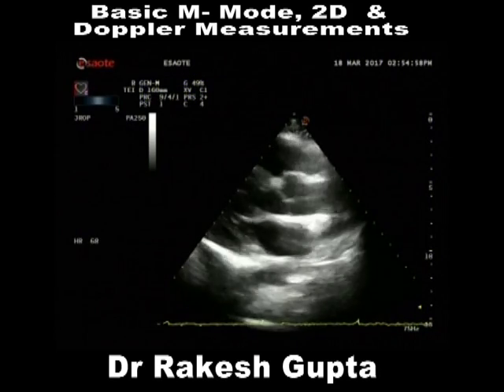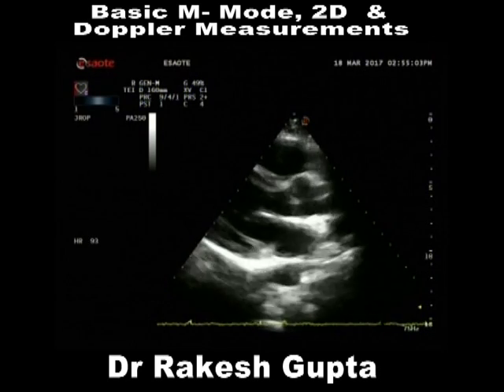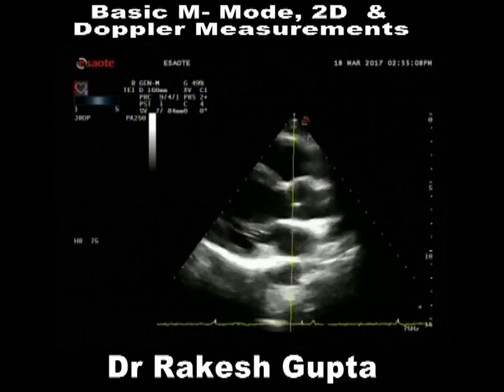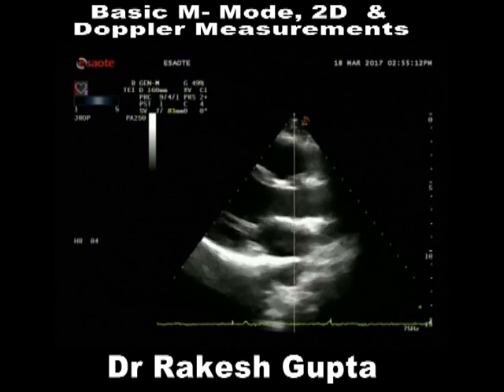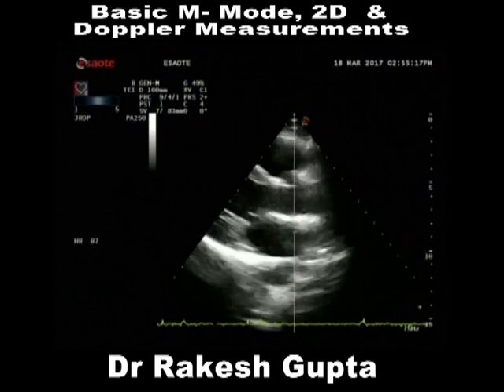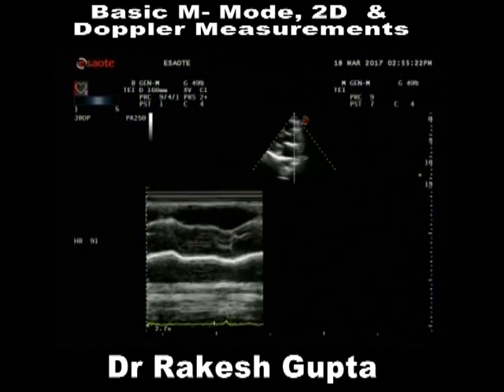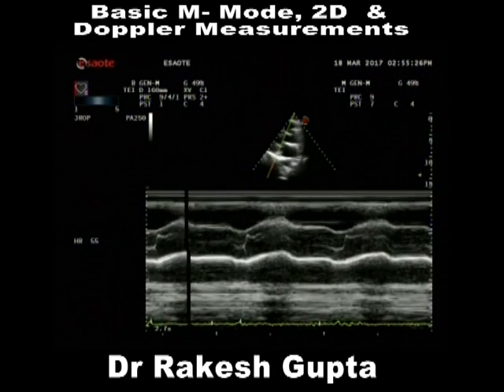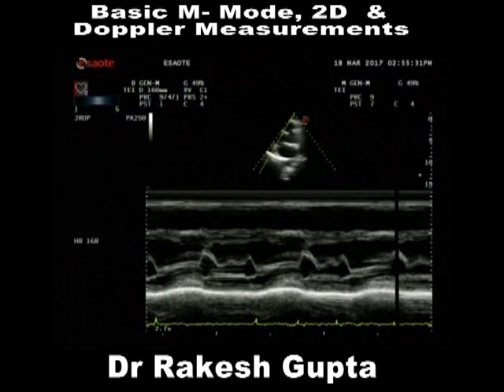So what we promote all the time is, we draw a line. Where is the line? Right into the center. This is the parasternal window, correct? I am intersecting what? Aorta and aortic valve leaflets. So I am taking an M mode. Then move my cursor to the tip of the mitral valve leaflets and then distally.